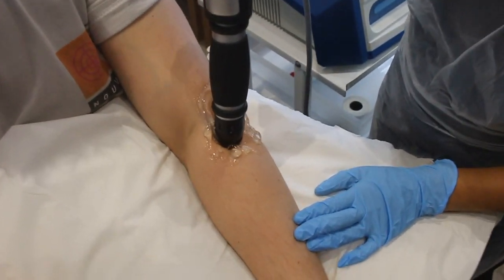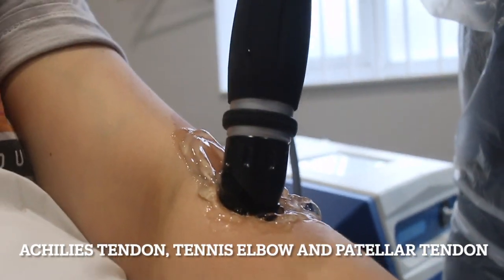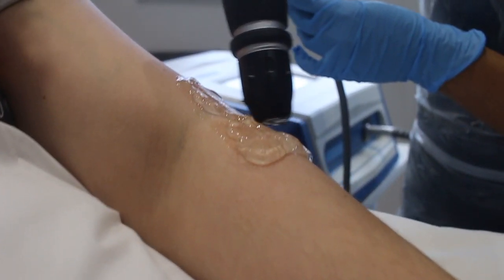So who is this for? Shockwave is perfect for those of us that have tendon issues. So I'm talking Achilles tendon, tennis elbow, patellar tendon — especially those pesky issues that seem like they're not really going away. Shockwave is perfect.